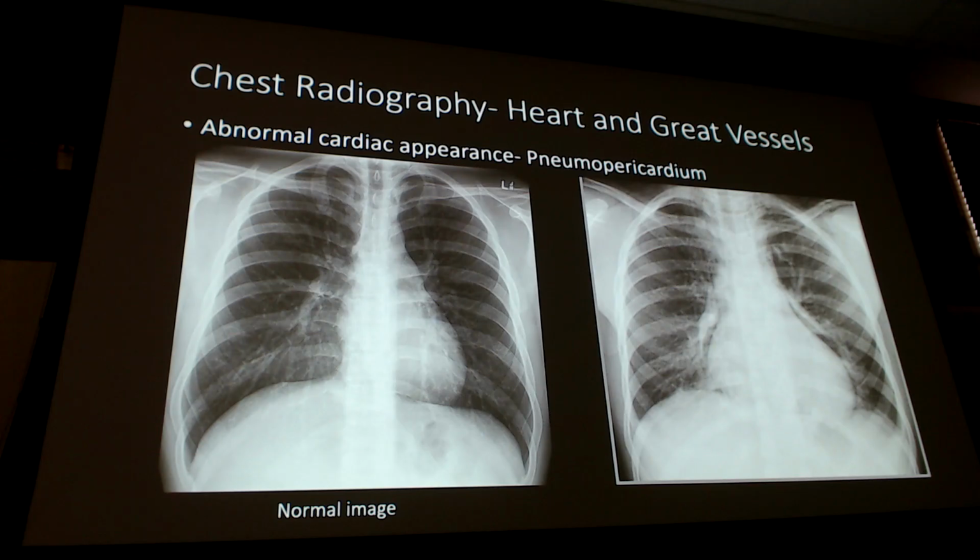Right. Another picture of a pneumopericardium. Right here. And right there. Right here. And right there. Now I'm going to take a look and I'm going to say, do I see a pneumothorax? I admit the quality is kind of iffy on some of that area there. Anybody see one, potentially? I don't really see one. Doesn't mean it's not there.